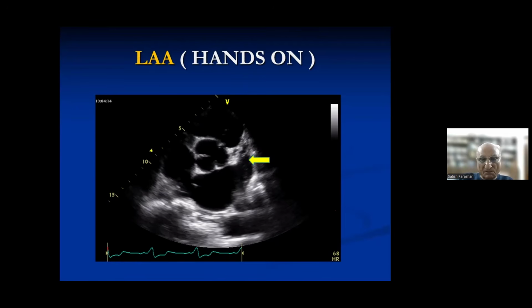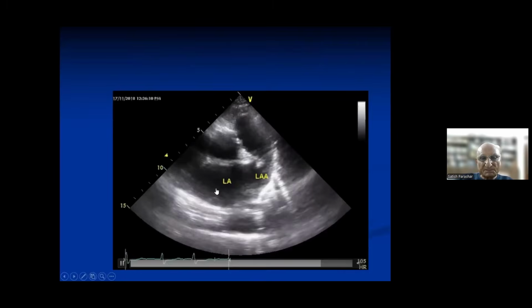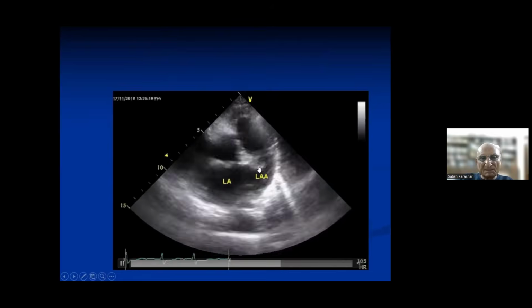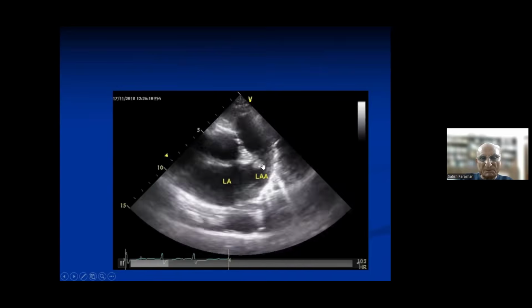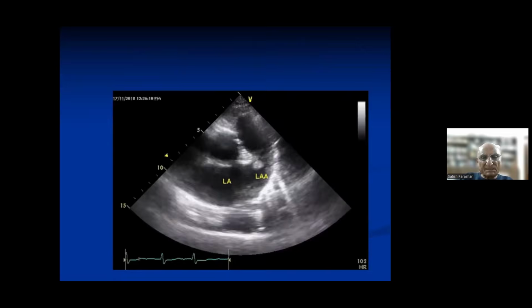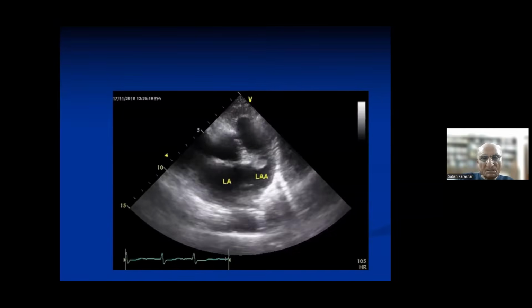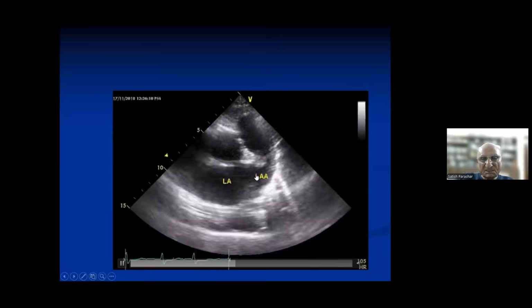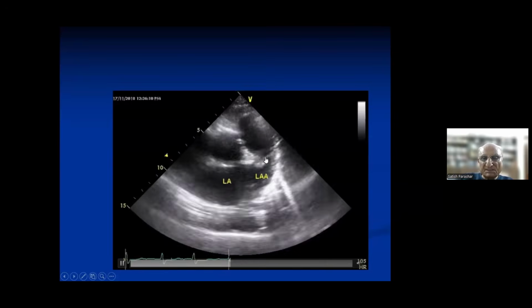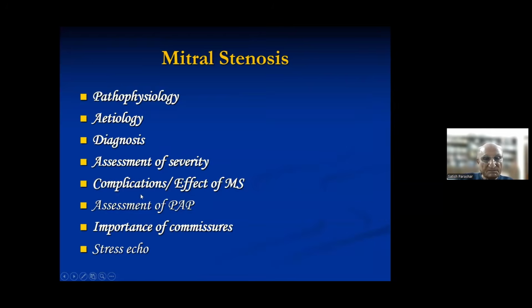So we have to wait till then. And sometimes you can see a clot in it. You see the moving clot. This is the LA appendage, and you see a moving clot. So these are some of the contraindications for doing a balloon valvotomy, so you have to see the LA. The best technique is transesophageal echo, but still it is worthwhile to see this, and in our hands-on, we insist that in all patients, you record the LA. How do you record it? It is very easy, and I'm sure all of you will try to do it from the second day onwards.